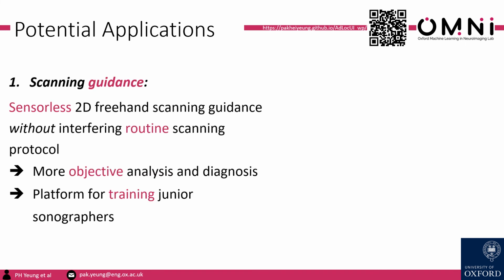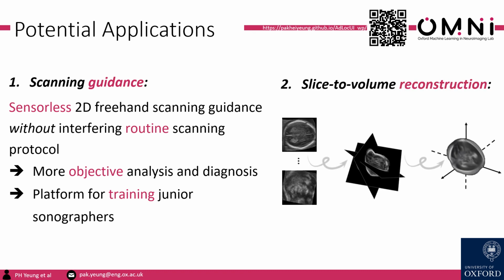For example, it can be used for sensorless scanning guidance, which can be used for training and other purposes. Also, it can be used for slice-to-volume reconstruction. More importantly, our proposed framework is designed to generalize to different machines and settings, which is crucial for real-life applications.